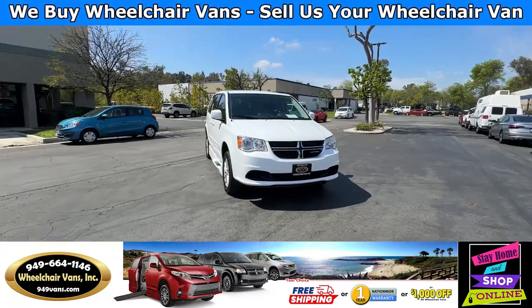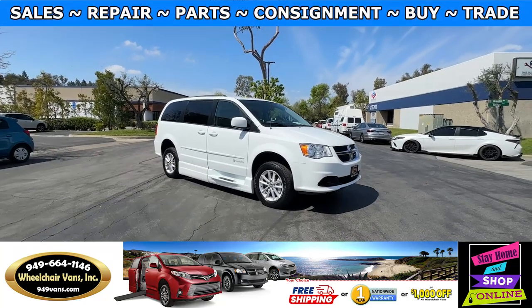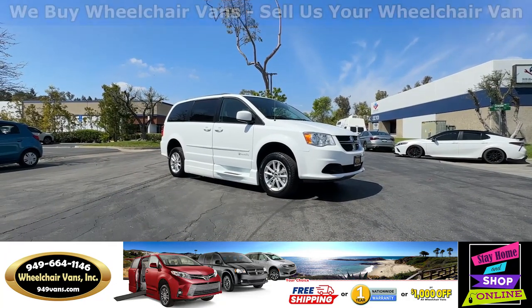Hello and welcome to Wheelchair Vans Inc. Today I'll be going over a 2015 Dodge Grand Caravan equipped with the BraunAbility in-flow ramp.